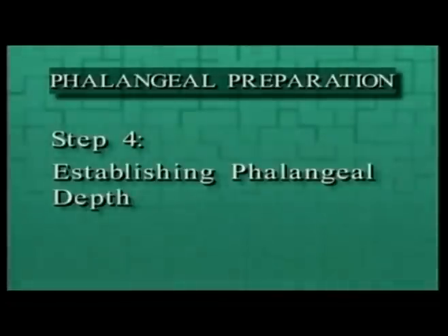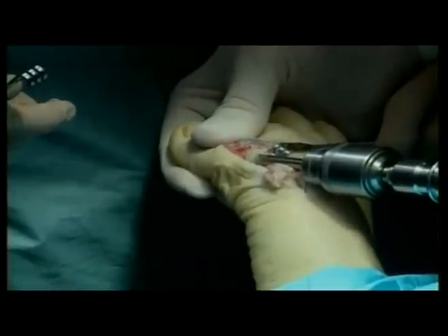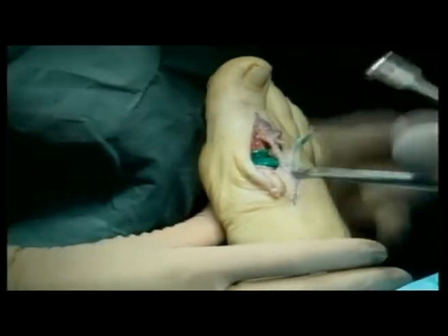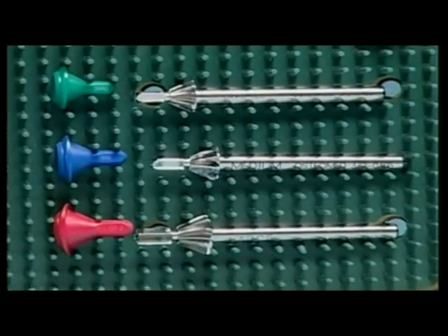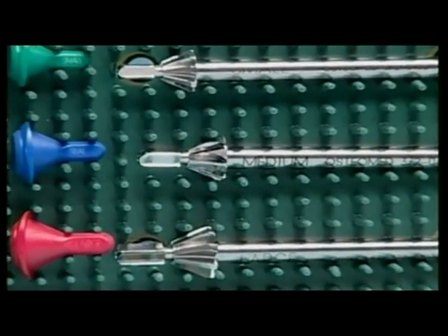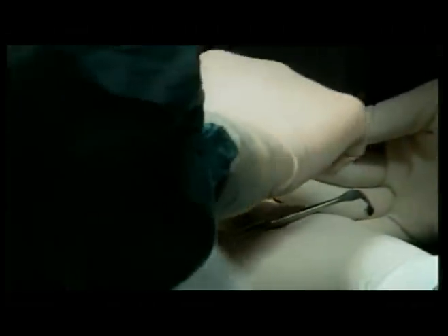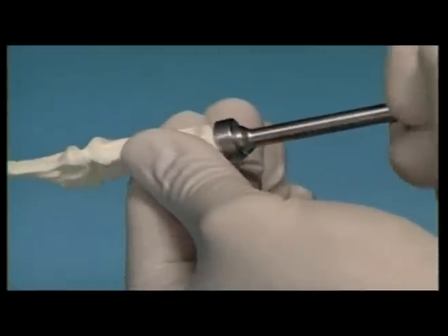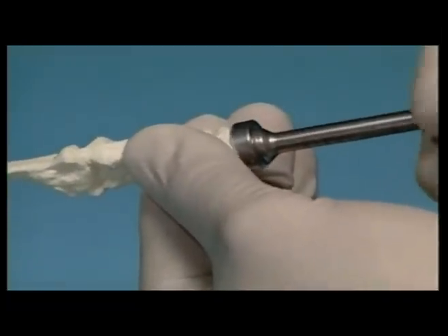Step 3: Reaming the proximal phalanx. Place the starter straight reamer over the guide pin and advance it just enough to break through the dense subchondral bone of the base. Place the small phalangeal reamer over the guide pin and ream into the base of the proximal phalanx to the desired depth. Step 4: Establishing the phalangeal depth. The depth and position of the cone determine the final position of the phalangeal component and the amount of dorsiflexion achievable immediately following surgery. Insert the small green plastic phalangeal sizer into the reamed phalangeal base and check range of motion. When the bone is completely planed, the base planer should turn freely on the smooth pilot without any resistance.